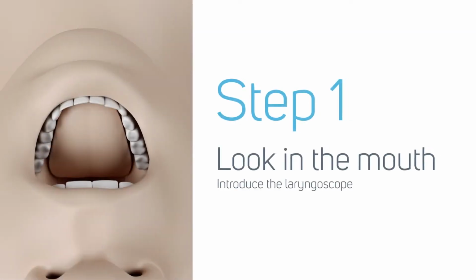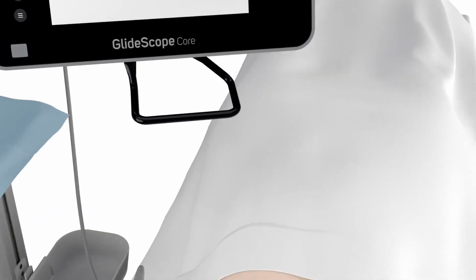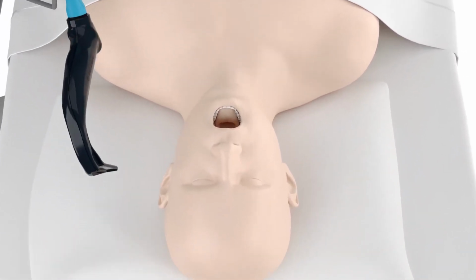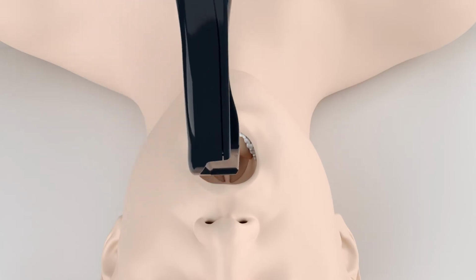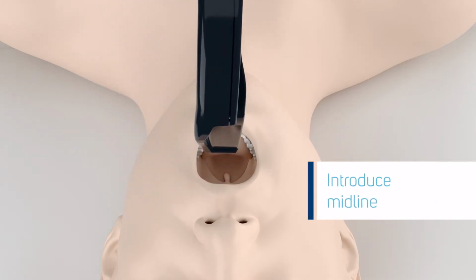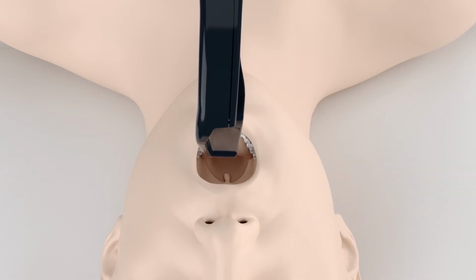Begin step 1 with direct vision, looking directly into the patient's mouth. With the patient appropriately positioned and with a GlideScope videolaryngoscope in your left hand, introduce the blade midline into the mouth. Unlike direct laryngoscopy, the hyperangulated videolaryngoscope is introduced midline. No lateral displacement of the tongue is typically required.